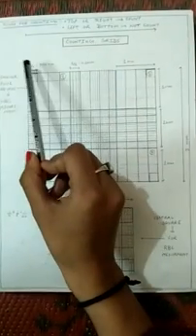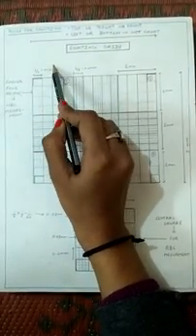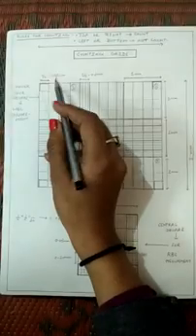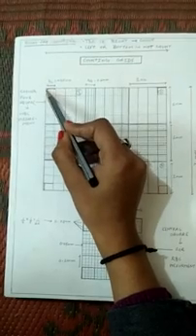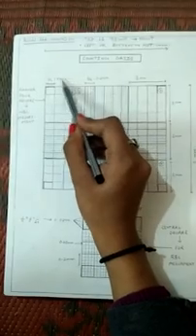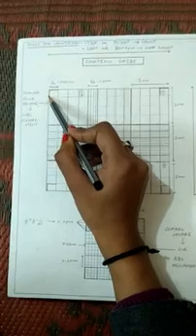So friends, if we say that this will be the length of one big square, then here you can see that the breadth of the square will also be 1, so the length and breadth of one big square are 1. So if this whole will be 1 square, then one division of it will be 1 by 4. Here you can see that this one square will be 1 by 4 or 0.25 in length. So friends, this will be the length of 0.25 and this will be the breadth, which will also be 1 by 4 or 0.25.